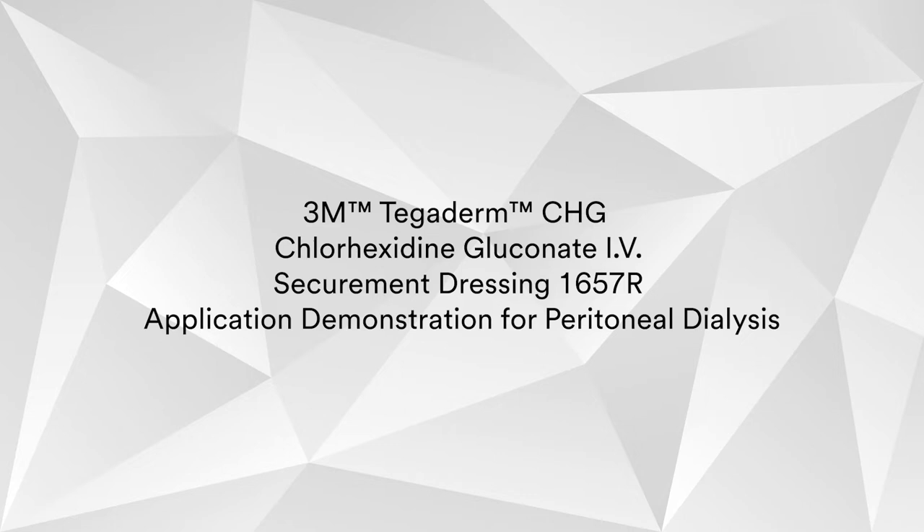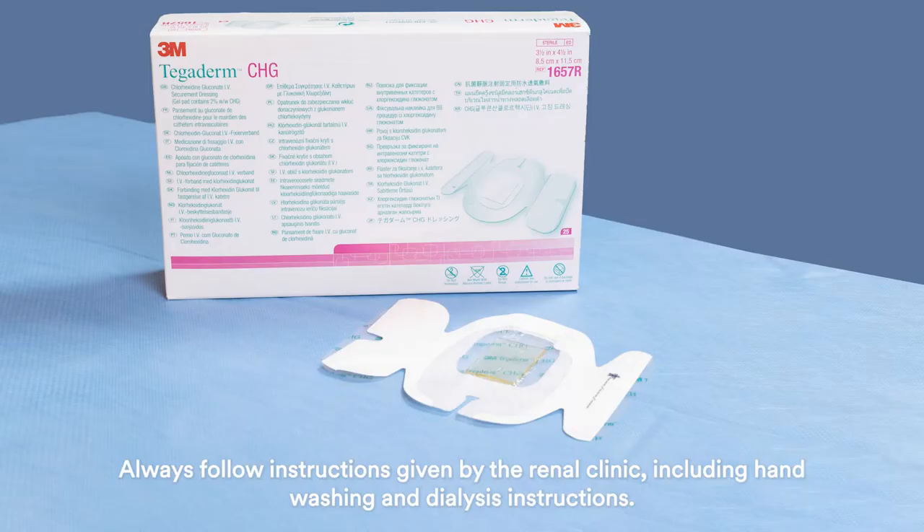3M Tegaderm CHG, Chlorhexidine Gluconate, IV Securement Dressing 1657R — application demonstration for peritoneal dialysis.